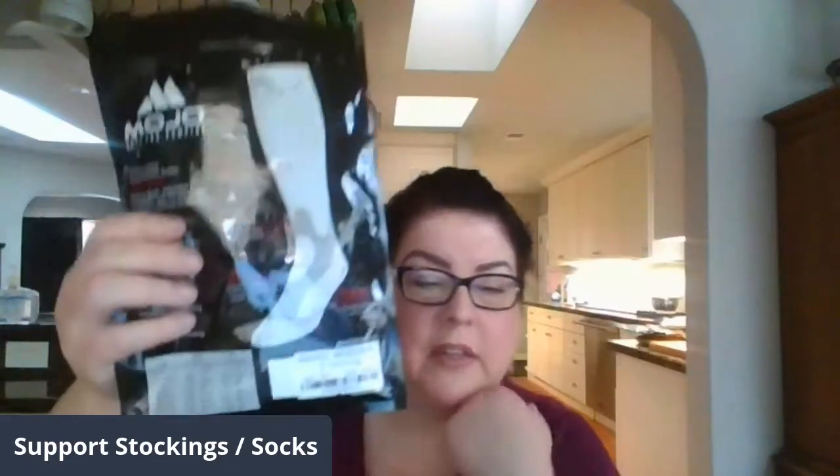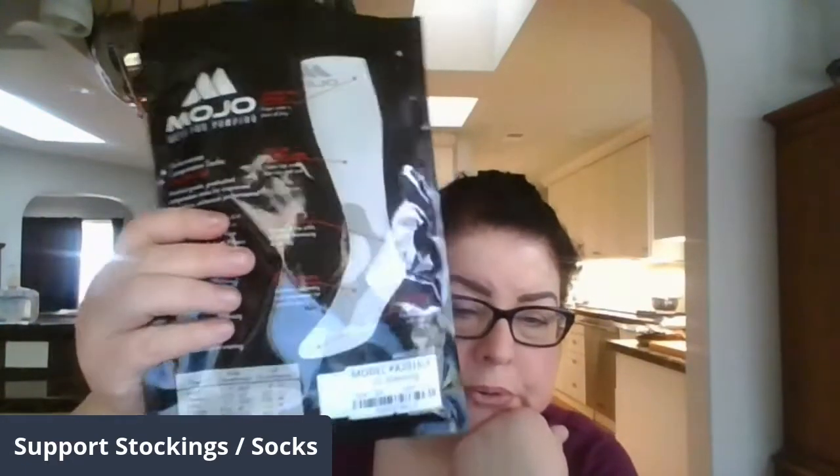I can wear them two days in a row, but I've noticed after washing them they come out of the dryer much better. They're expensive so I try to be gentle with them and I worry about washing them too much. My feet and shoes aren't stinky so sometimes I can go a second day. These are about $25 or $26 a pair.